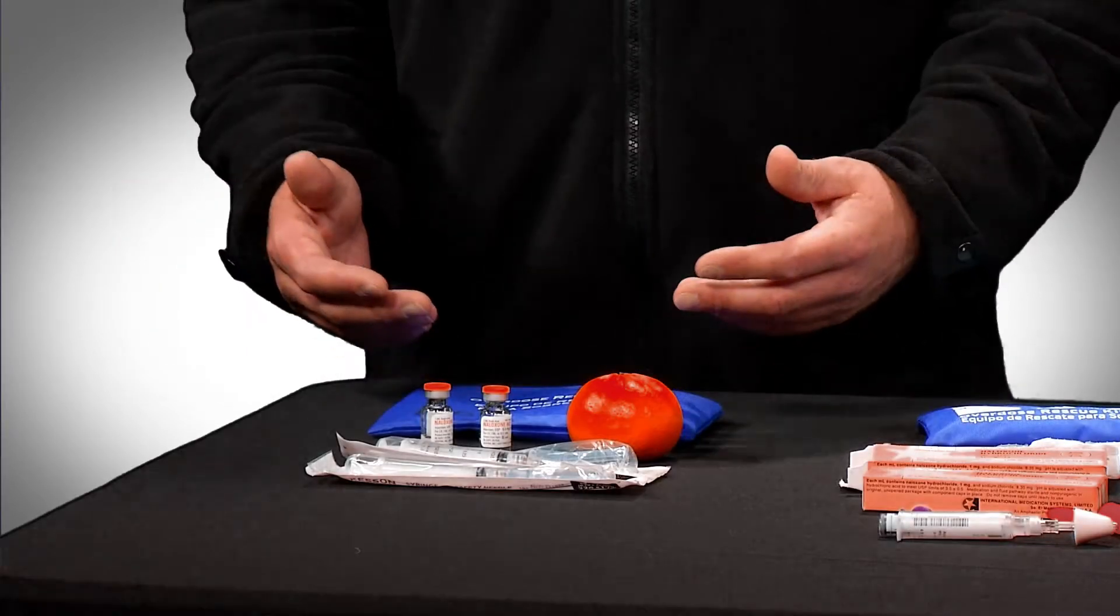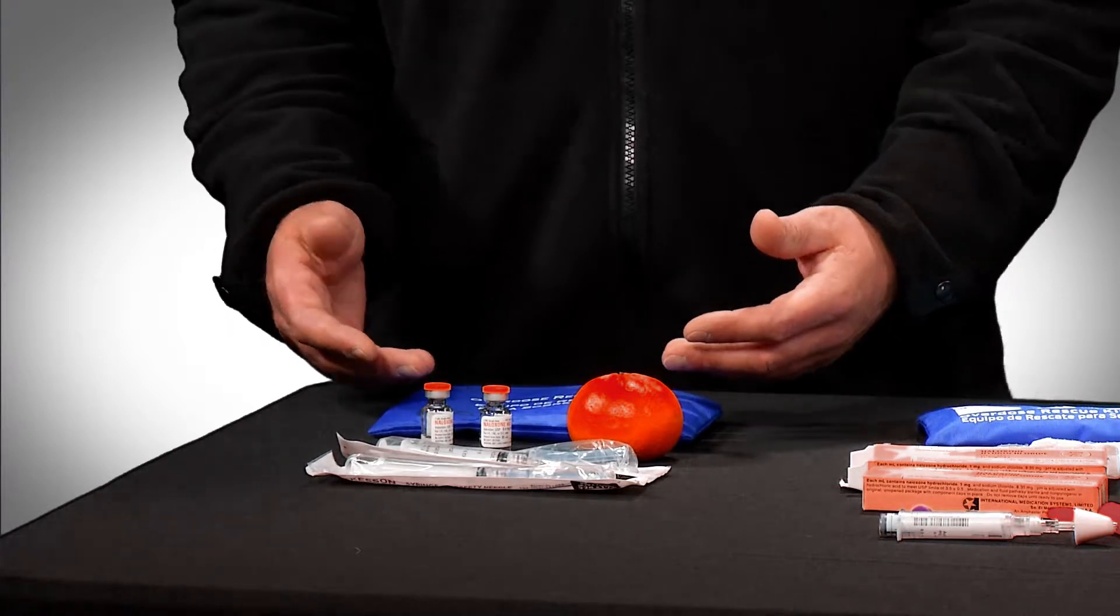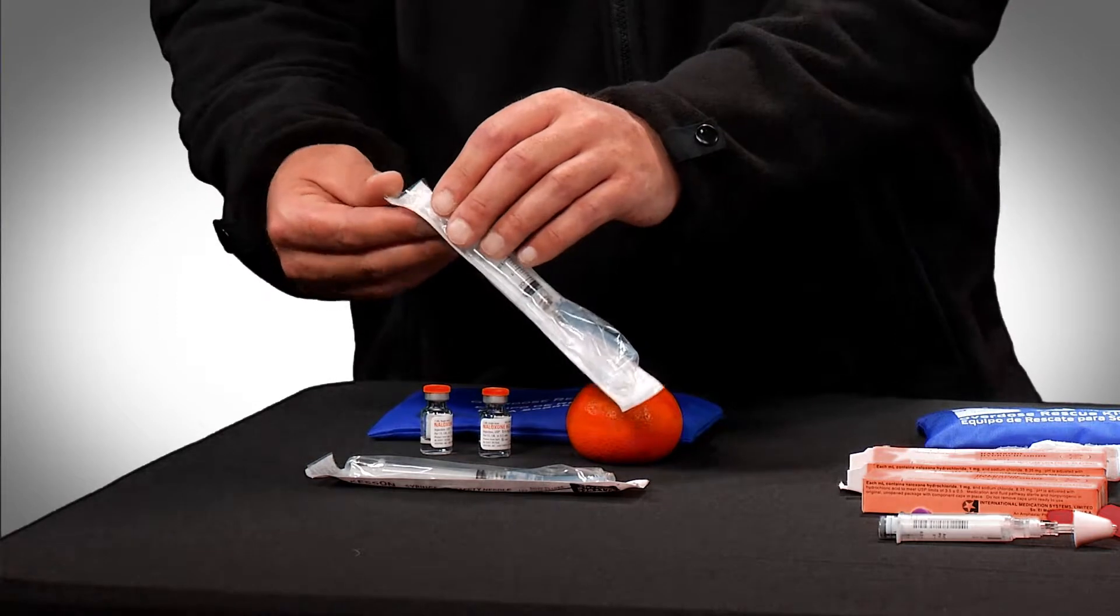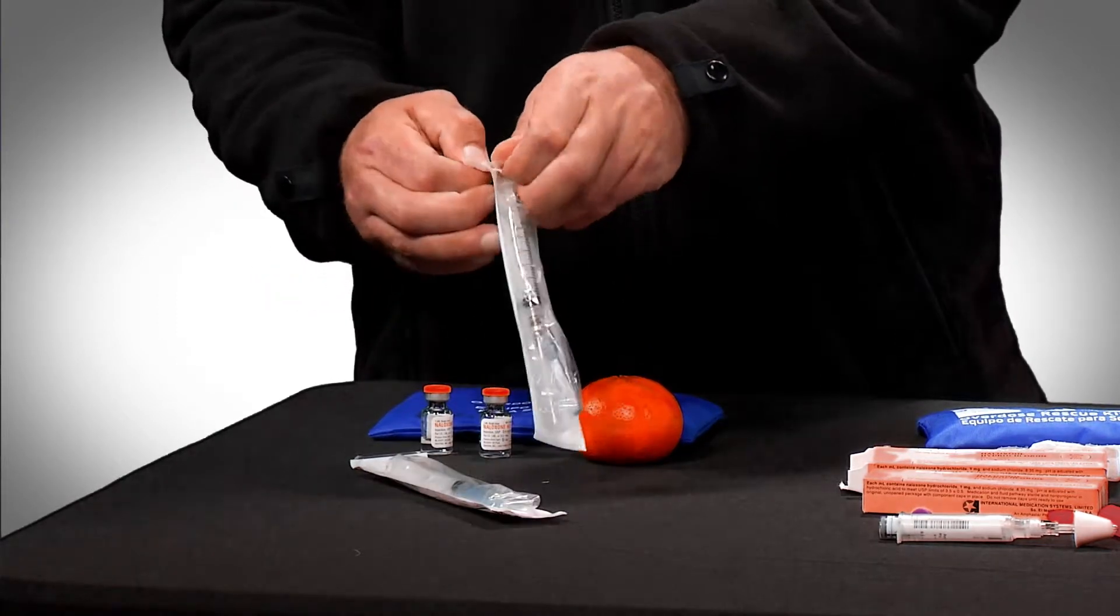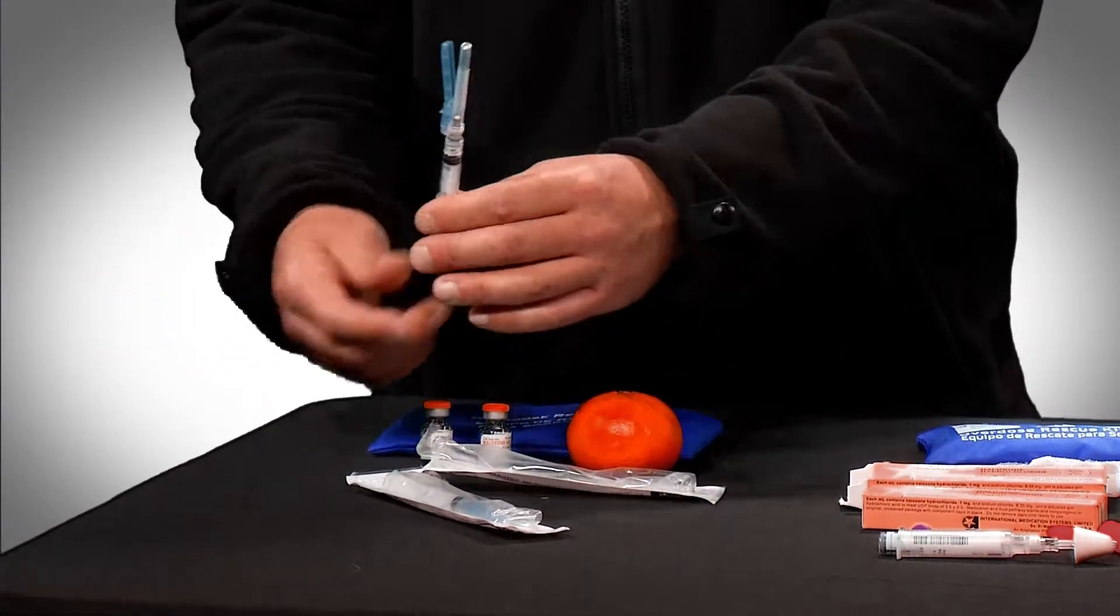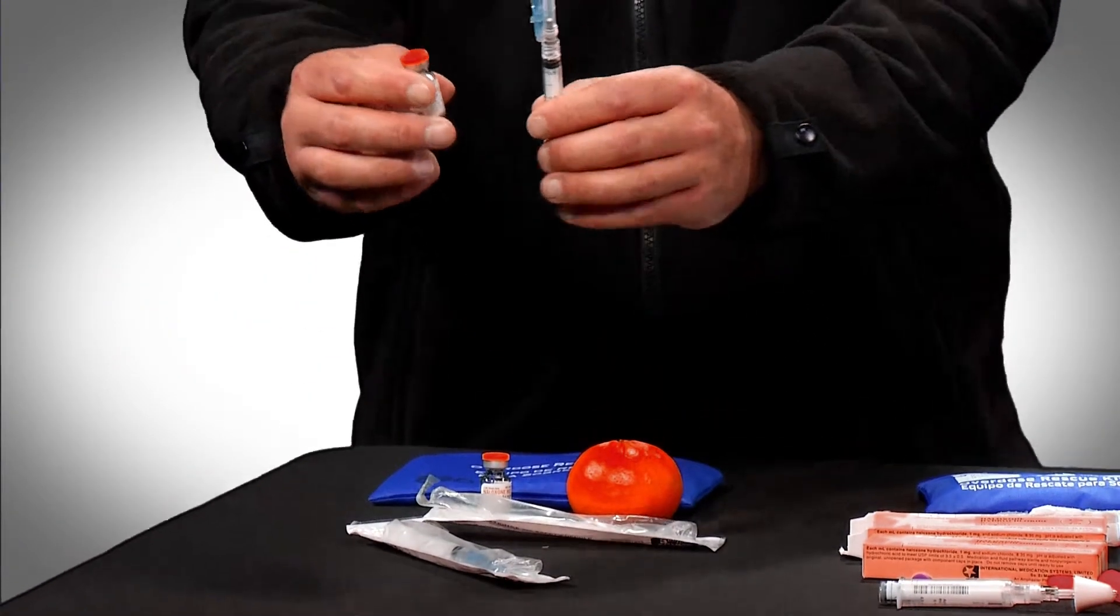You could also get the intramuscular injection form of naloxone from the pharmacy. With these kits, all you do is grab one of the intramuscular injection syringes, peel it out of the package, get one of your naloxone vials, and pop off this orange cap.